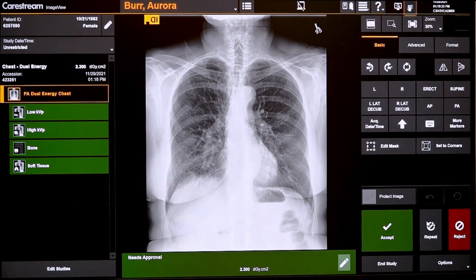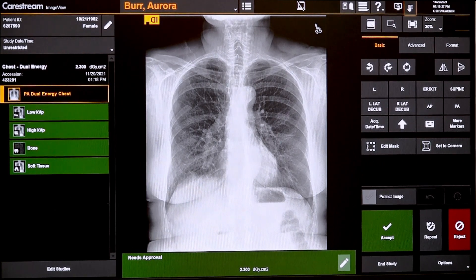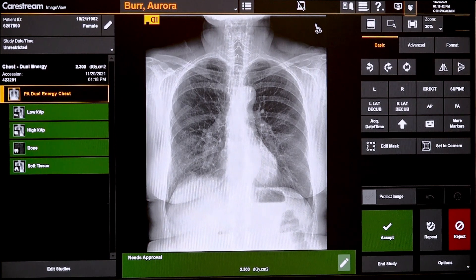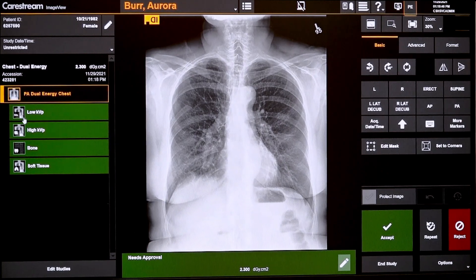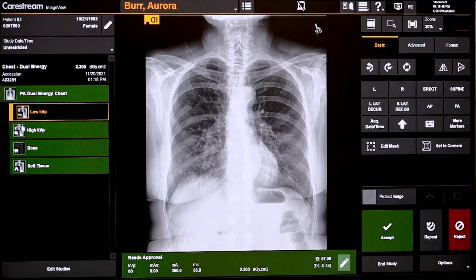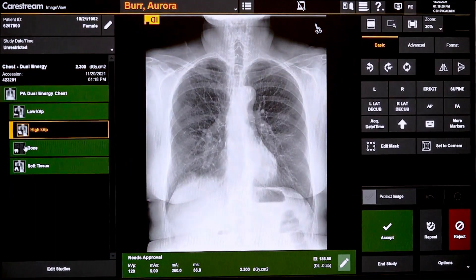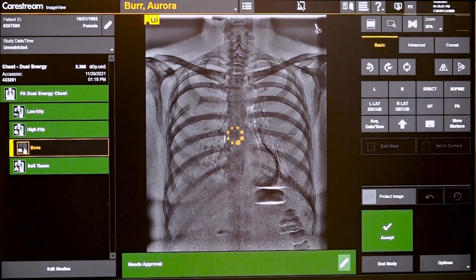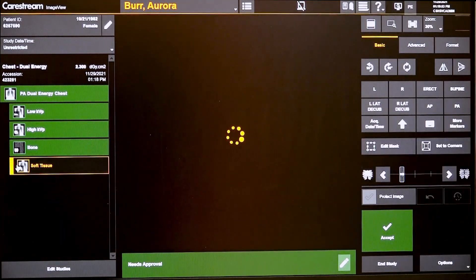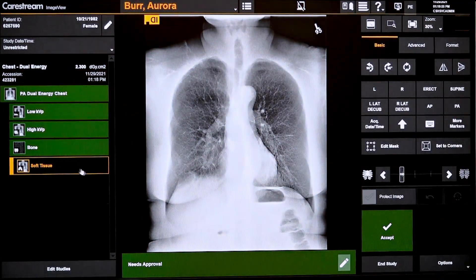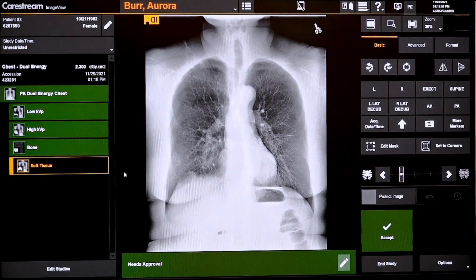Once we've acquired the low energy and high energy shots, we subtract those images to create a bone image and a soft tissue image, as well as a composite. On the left hand side here you can see the composite at the top, the low energy shot, the high energy shot, and then also the bone and soft tissue.